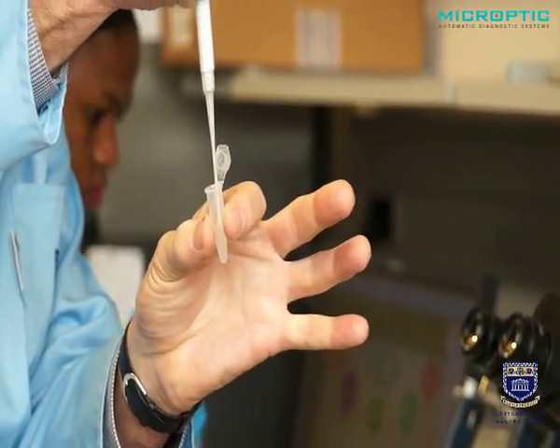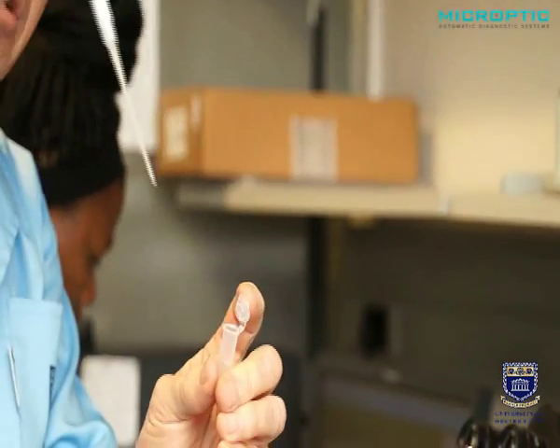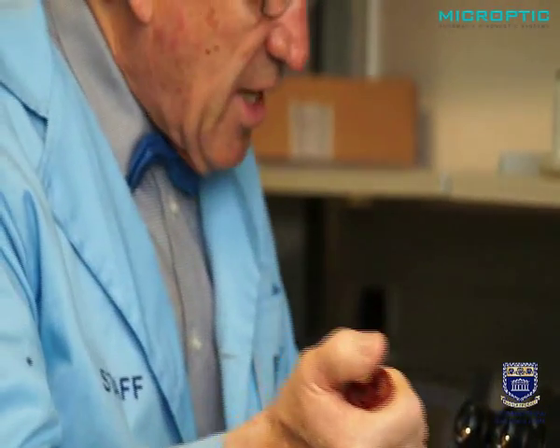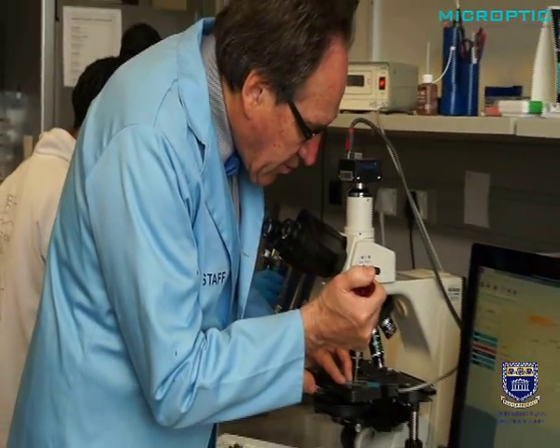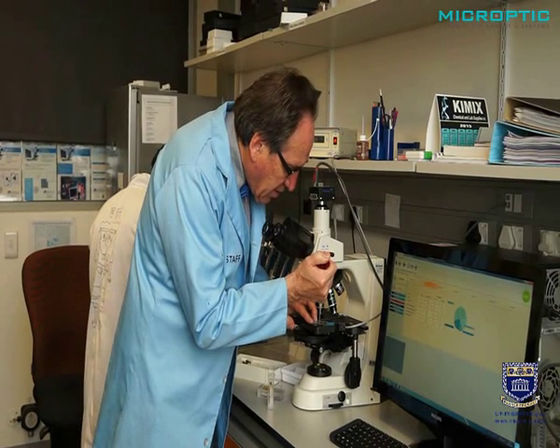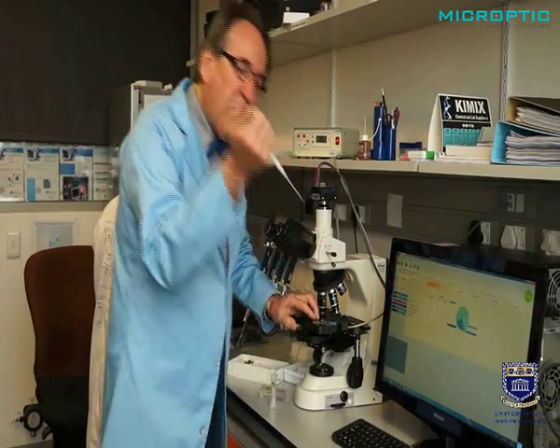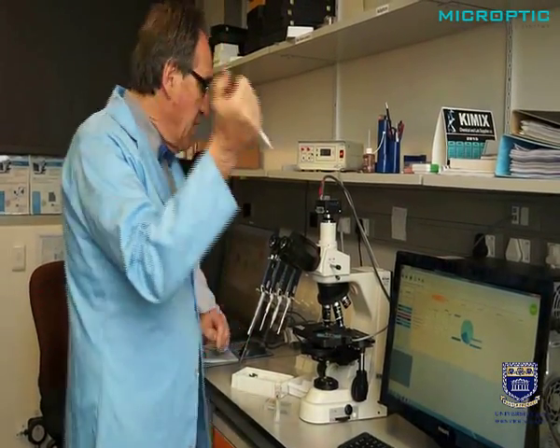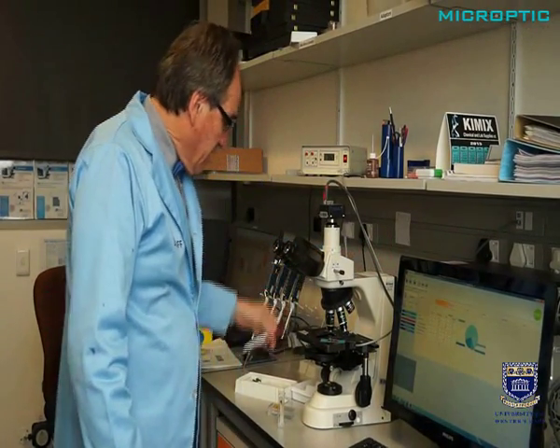and pipette it slowly, no air bubbles, no negative pressure, and onto the slide, which has been temperature heated, controlled, and of course inserted into your particular chamber very slowly. And what is good about this pipette is that it now displaces absolutely all the semen. No semen sticks to the sides.